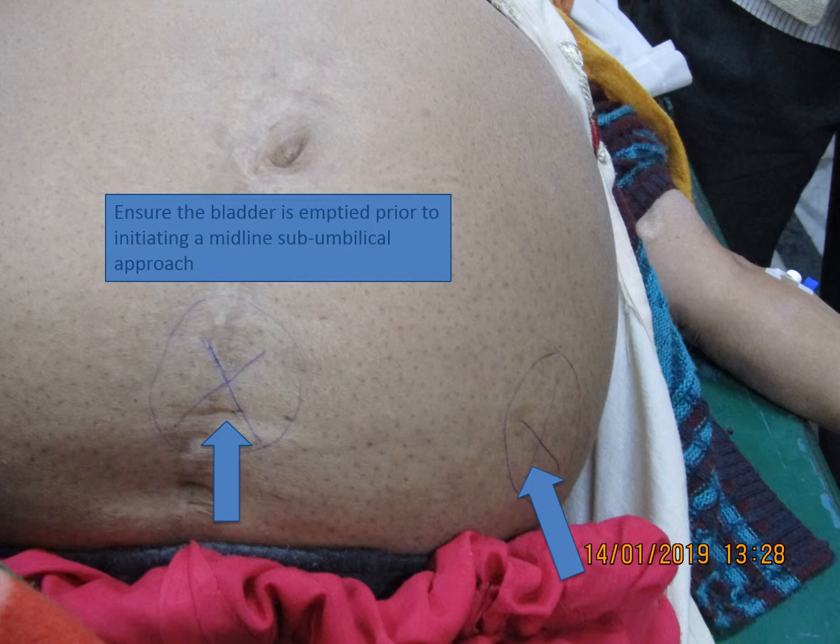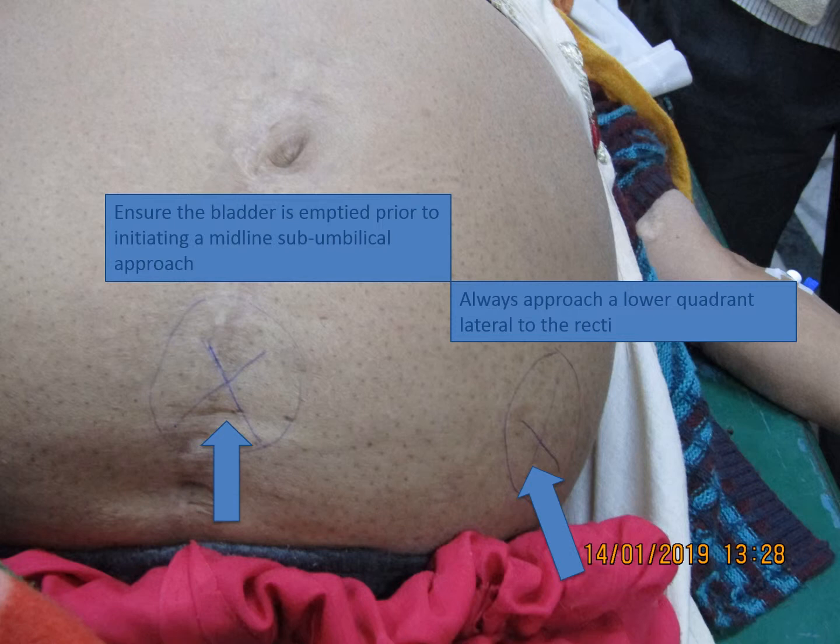Areas of surgical scars, such as a midline scar in this patient, should be avoided as bowel may be adherent to the peritoneal surface of the abdomen at these locations. This most frequently is an impediment to the right lower quadrant approach secondary to an appendectomy scar. In cirrhotic patients on lactulose, excessive gas produced during its bacterial metabolism may result in a dilated cecum, so a right lower quadrant approach is preferably avoided in such patients. In either of the lower quadrant approaches, the site of needle entry should be ensured to be lateral to the border of the rectus abdominis muscle to prevent injury to the inferior epigastric artery.